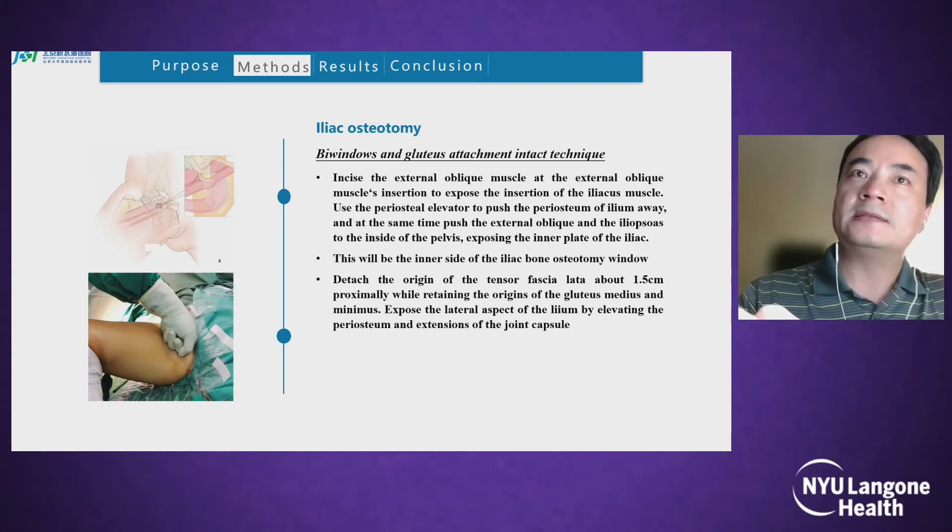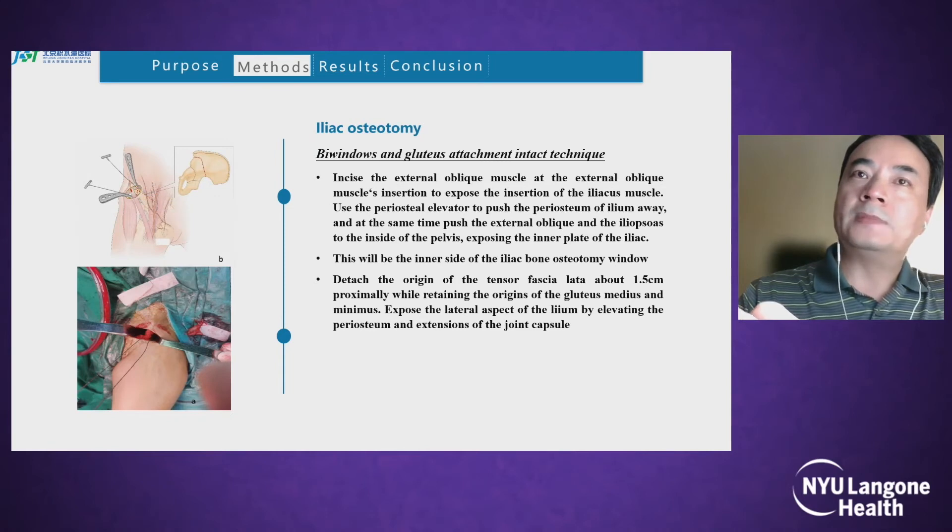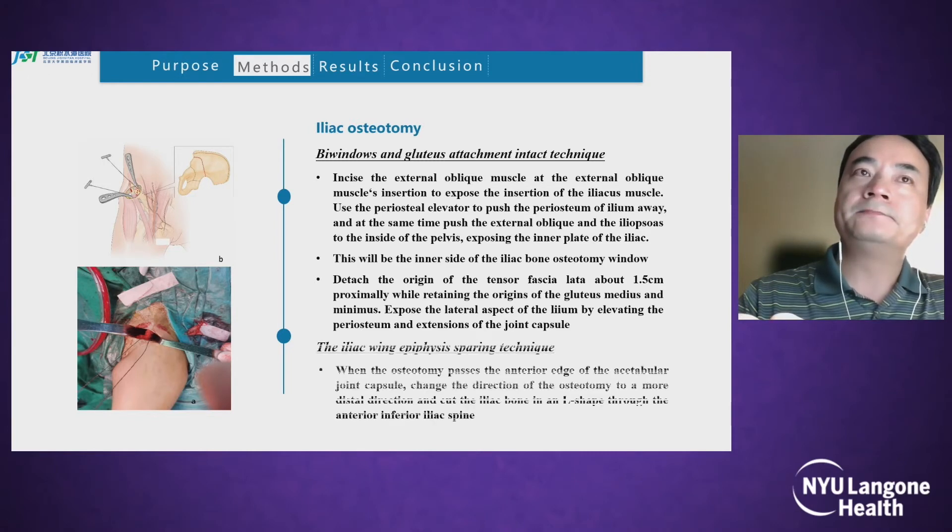Detach the origin of the tensor fasciae latae about 1.5 cm proximally, while retaining the origin of gluteus medius and minimus. Expose the lateral aspect of the iliac by elevating the periosteum and extension of the joint capsule. When the osteotomy passes the anterior edge of the acetabular joint capsule, change direction to a more distal direction and cut the iliac bone in an L-shape through the anterior inferior iliac spine.